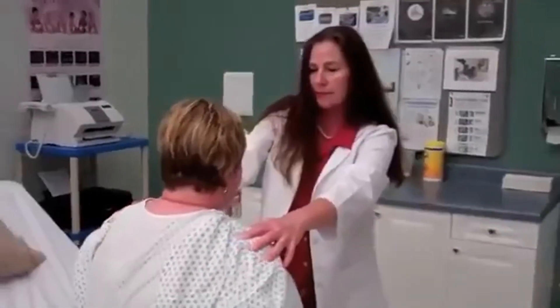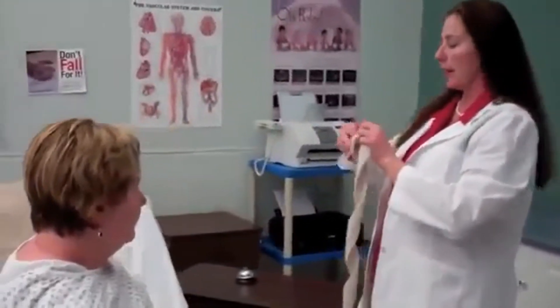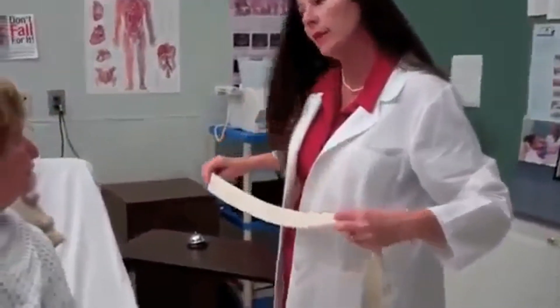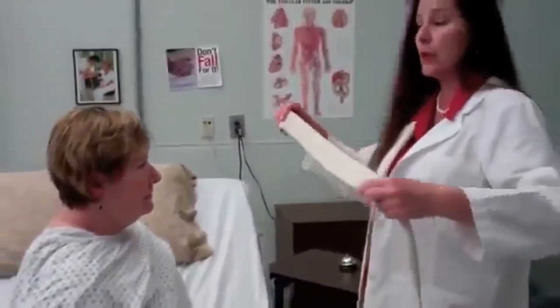Do you have your balance? Yes. I'm going to go ahead and put this belt around your waist. It will be a little bit snug at first.